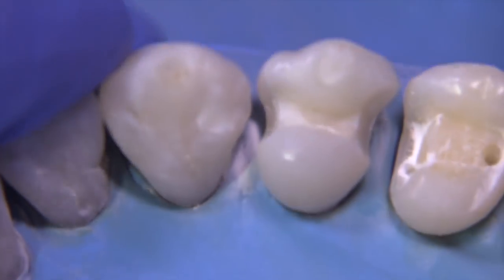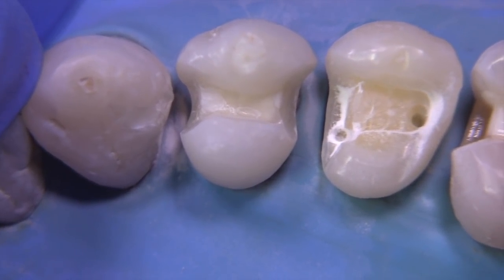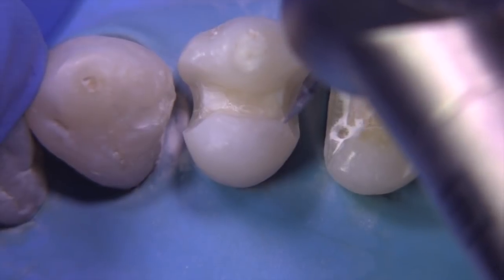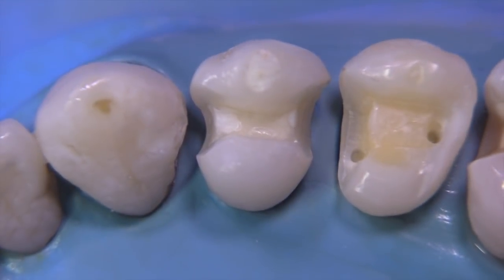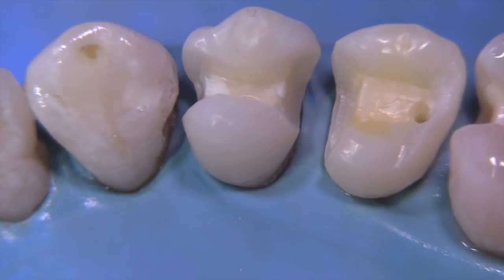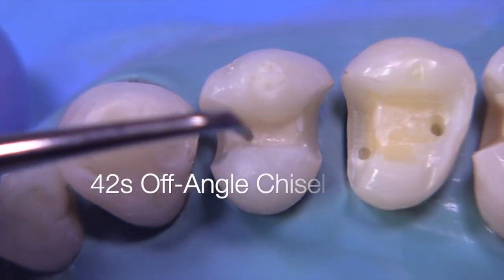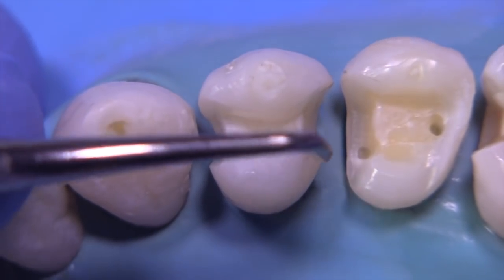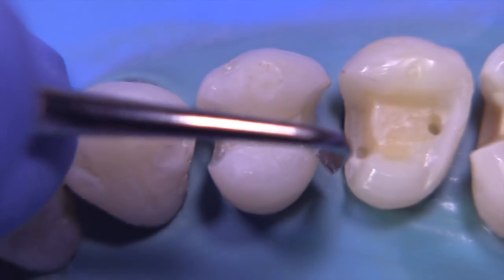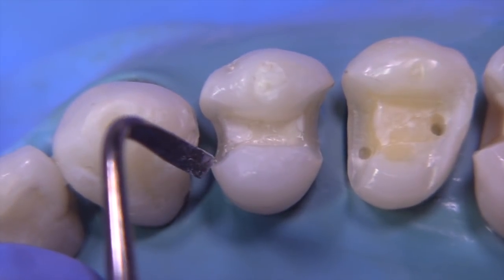Now even though this preparation would seem like it doesn't have a lot of retention and resistance form, the opposite is true. They're incredibly retentive, incredibly resistant. Any sharp edges should be rounded off just a little bit. Now you can see that we have the nearly completed preparation. The 42S off-angle chisel is pretty good to smooth off the pulp floor and maybe remove any enamel rods that are loose. So that's basically it — the preparation is complete, pretty simple.